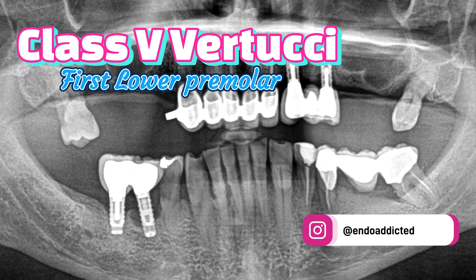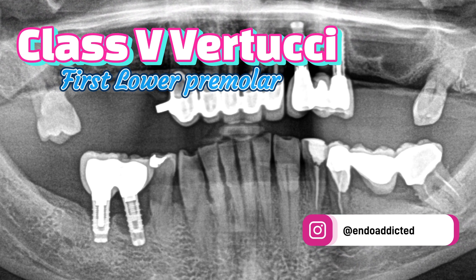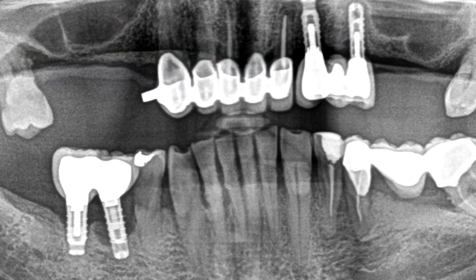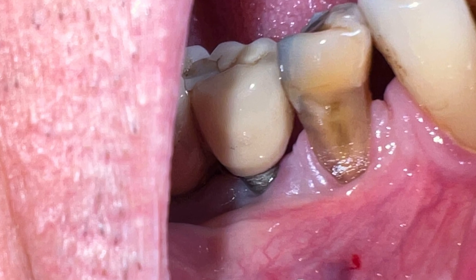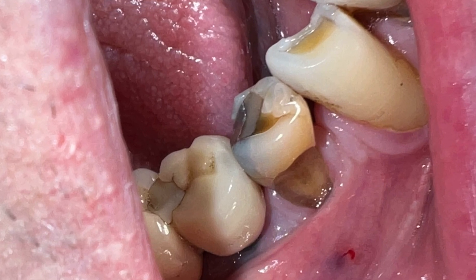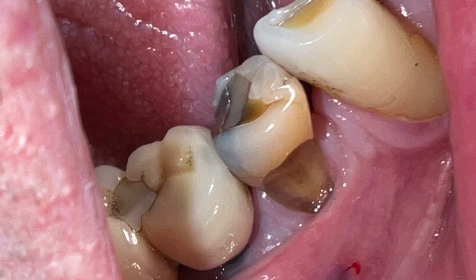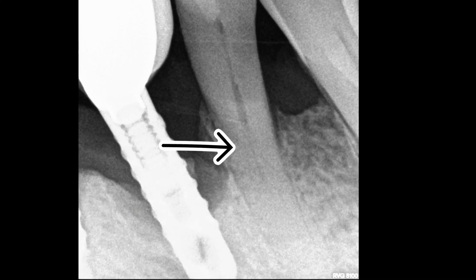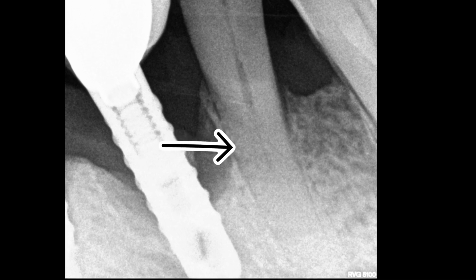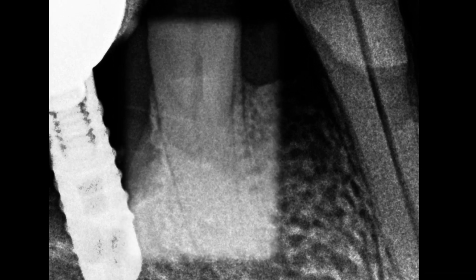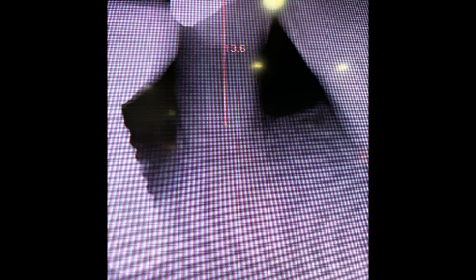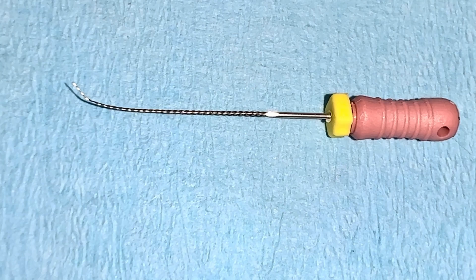This is a type 5 canal — a single canal exiting the pulp chamber which divides into two canals with separate apical foramina. When the root canal disappears in the middle third, it is because there are several canals. The use of fine pre-curved steel files is mandatory in this type of case.